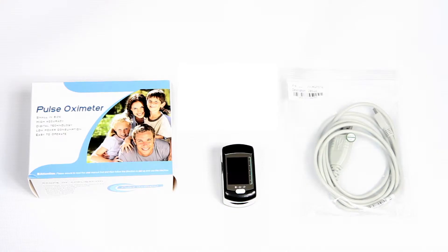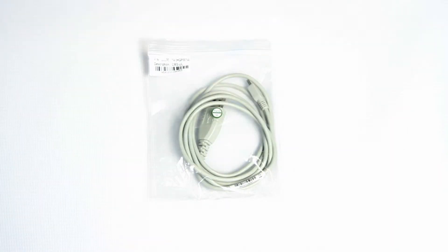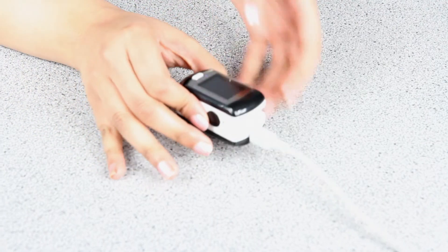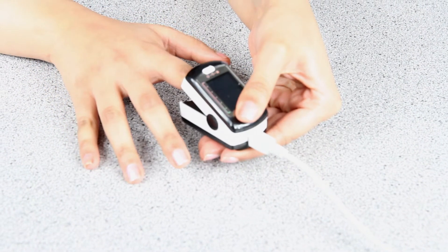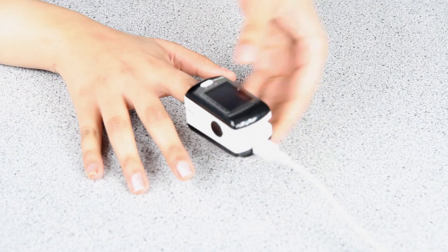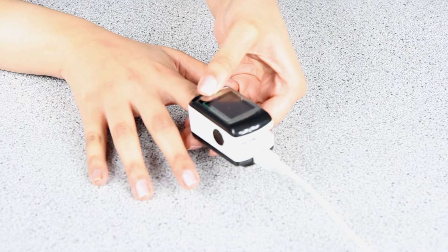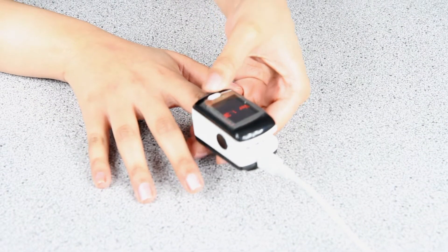Using the special beige cable supplied with your Activate Our Lives pulse oximeter, connect the device to a USB port on your computer. Place your finger into the device all the way to the end and press the button firmly once.